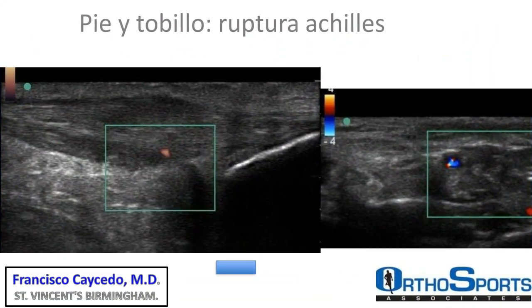Another very important factor, we can do color Doppler, and it can show you the circulation and also inflammatory factors. It's so graphic and so beautiful that when it's red, that means it's artery because of the velocity of the flow. And when there is less flow, you see blue. So it's amazing how didactic this instrumentation is.